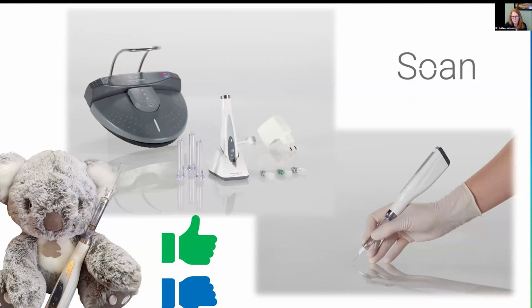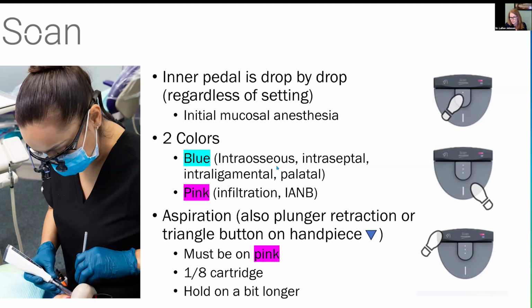The Soan, you know, it's sexy, it's cordless, it's the latest and it's the greatest, and it's all those things, and I use it every day too. But the difference is there's a whole lot of settings. The inner pedal, it's slightly different color. It doesn't really show it that well, so you can see it, but it only has 2 colors. Blue is for intraosseous, intraseptal, intraligamental, and palatal, but pink is for the infiltration and inferior alveolar nerve block. And you must correlate the device. If you get more than one device, which I recommend, one for every chair you do operative in, keep it easy. You have to have the correct pedal with that device. Otherwise, it doesn't work. I learned the hard way.